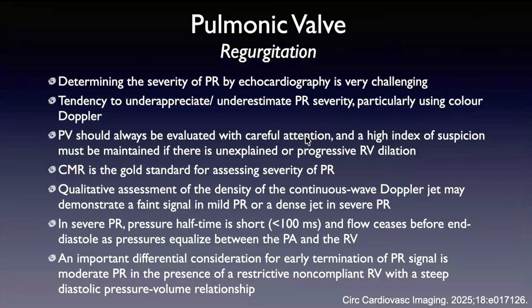The pulmonic valve should always be evaluated with careful attention and a high index of suspicion, especially if there's unexplained or progressive right ventricular dilatation. If you see that right ventricular volume overload, then really look carefully at the pulmonic valve. As I mentioned before, CMR is the gold standard.